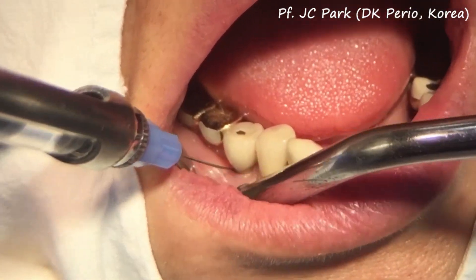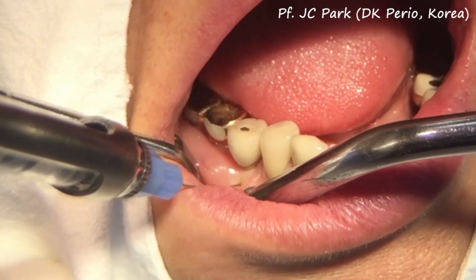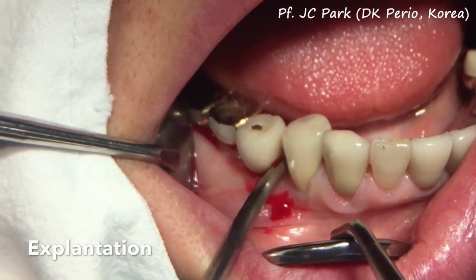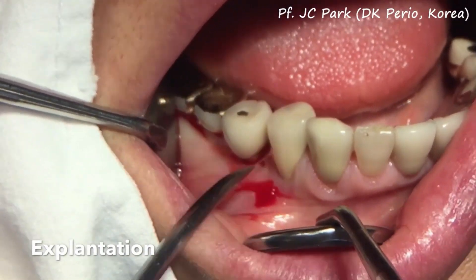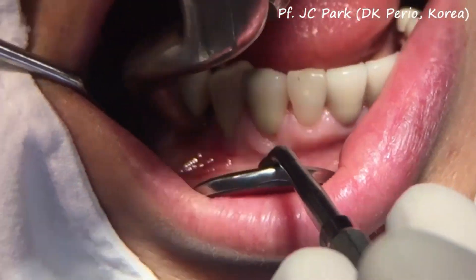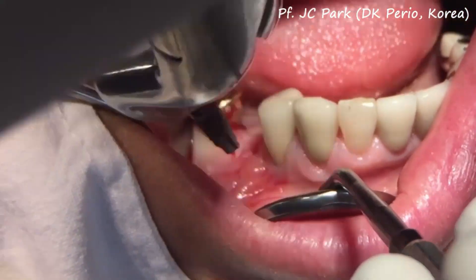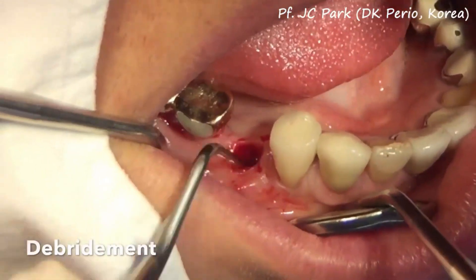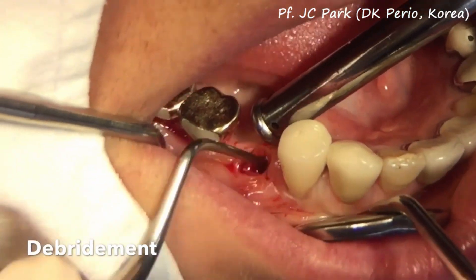After local infiltrated anesthesia, the implant was easily explanted with the elevator and a dental extraction forcep. After explantation, the inflammatory tissue was completely debrided.